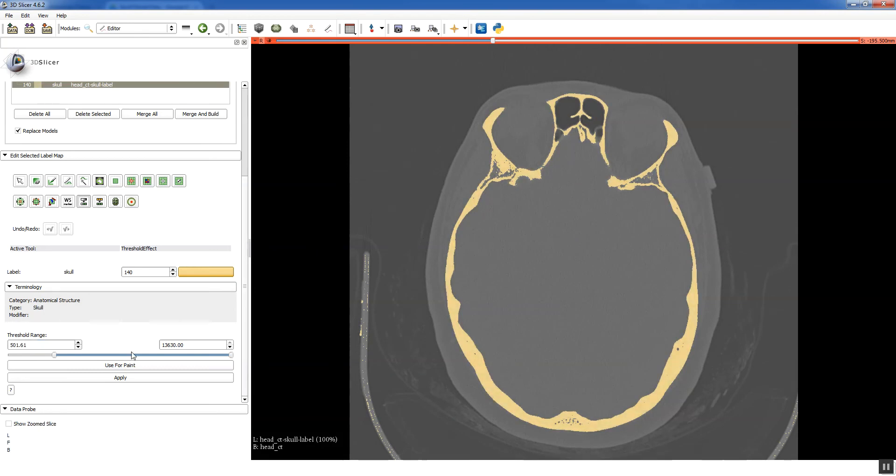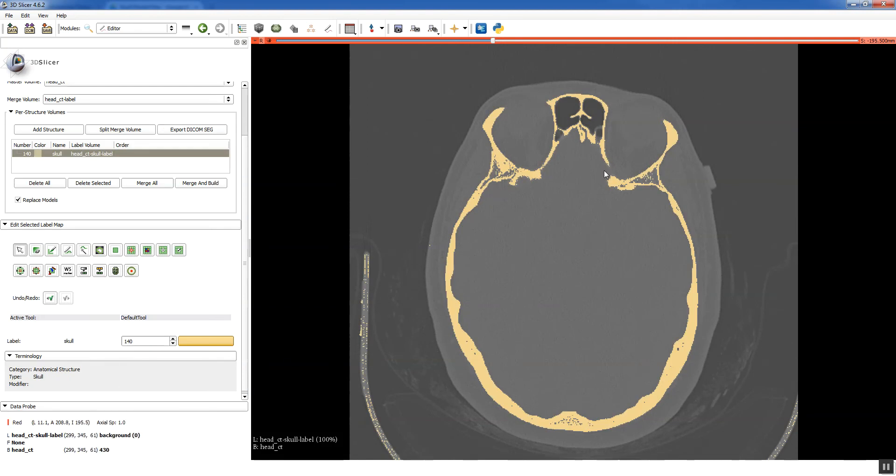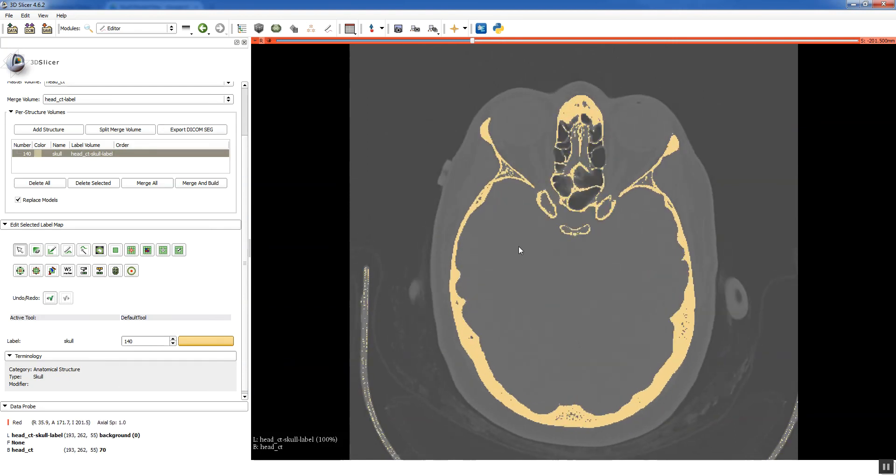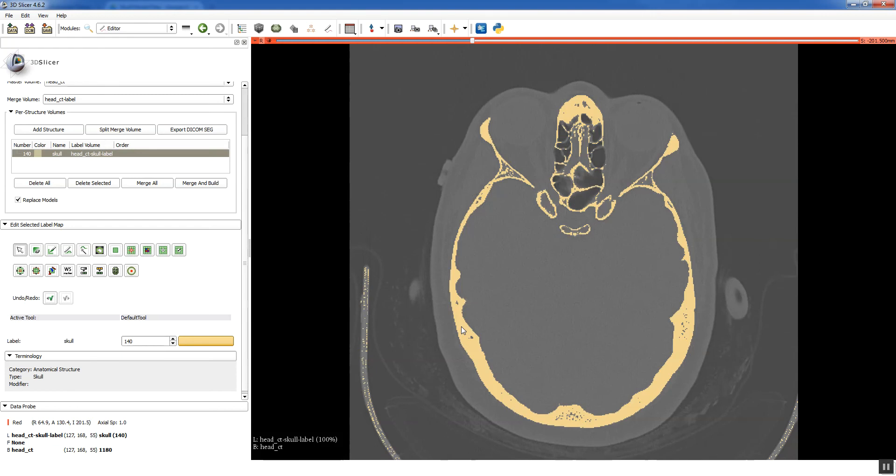Now the last thing is you have to actually apply this threshold. So you click the Apply button, and now that label sticks around. So I talked about the data probe earlier. If you hover over your segmentation here, look at the data probe, and you'll see it says Skull with 140. And basically that means that the value of your label is 140. And that's important to pay attention to when it comes time to segment multiple structures and try to save different files. So it's good to be aware of that from the beginning.